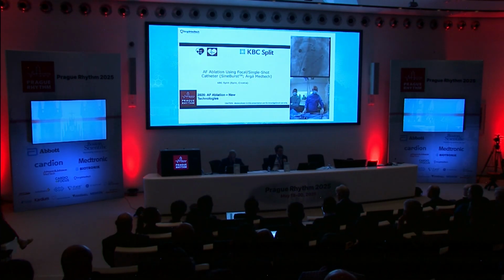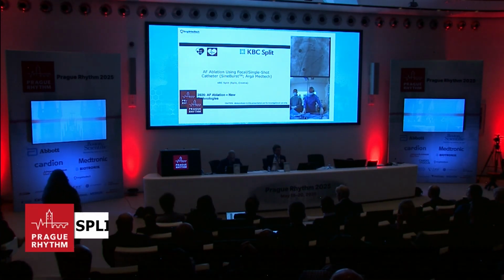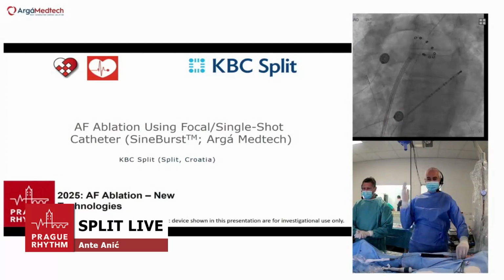Hi, Professor Kastner. Yeah, we can. Hi, everybody. We can see you. Everybody can hear from you, Split? Hopefully. Good. You can start the procedure, or you can show us what you have. We will. I let Tony give you a short introduction to the case, and then we proceed with the ablation. Tony, please.